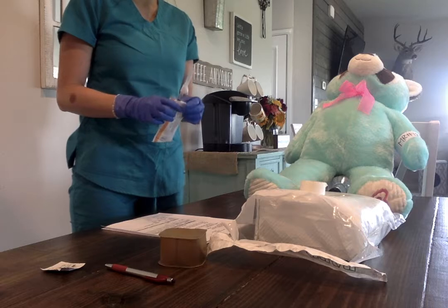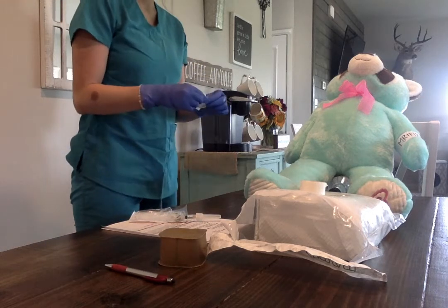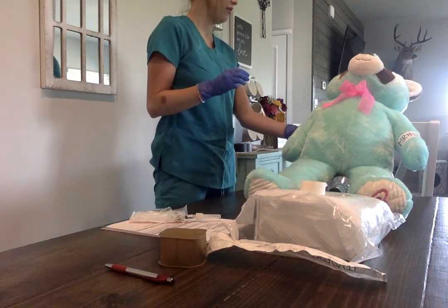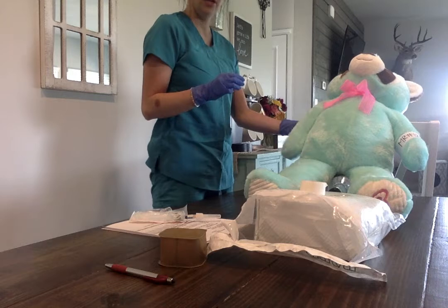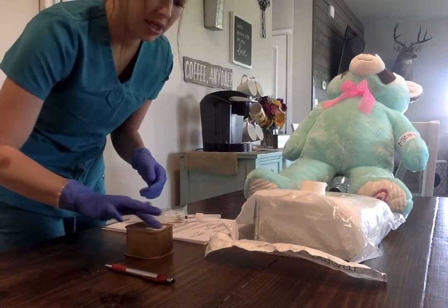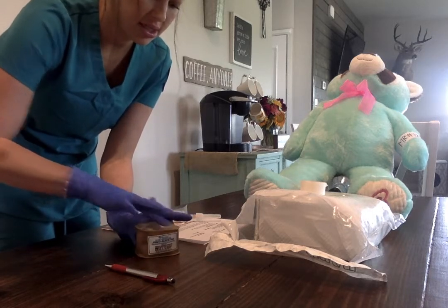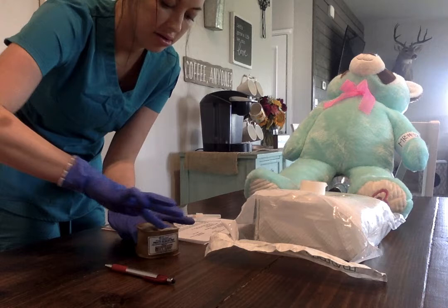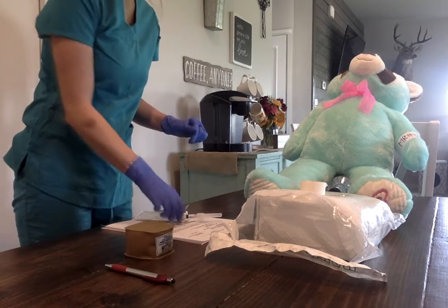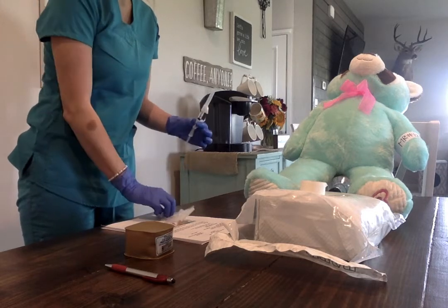So, yeah, I'm going to start by cleaning your arm, because we are giving it sub-Q, so I'm going to give it right back here on your arm. I'm going to start by cleaning your site from inner to outer for 30 seconds. Okay. Allow that to dry, no fanning it.